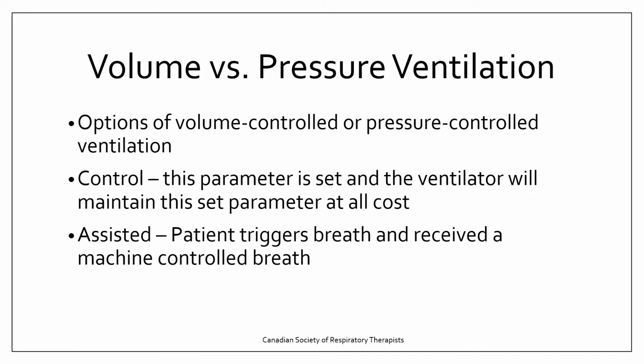You want to consider why they require mechanical ventilation. Does the ventilation problem require a special mode of ventilation? What are the treatment goals for the patient? Does a patient need an artificial airway, or can it be done non-invasively with a mask? Are they going to be ventilated in the intensive care unit, or are they going to be ventilated long-term or short-term? How long of the support? And really, how familiar are the staff with the ventilator and the mode?